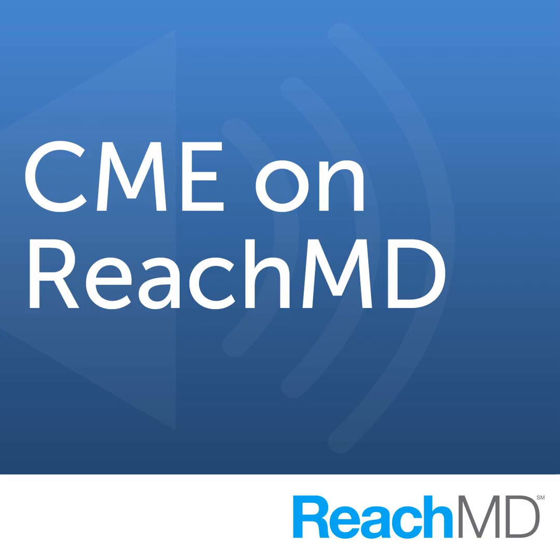And then finally, we have emerging novel imaging techniques. We can use molecular imaging with PET to study processes of fibrosis, inflammation, the role of the activated fibroblast in the myocardium of patients. And when we're using these techniques, we're trying to do three things. We're trying to make a diagnosis. That's obviously critically important. We're trying to risk stratify patients to understand which patients are most at risk of the life-threatening complications that can be involved with this disease.